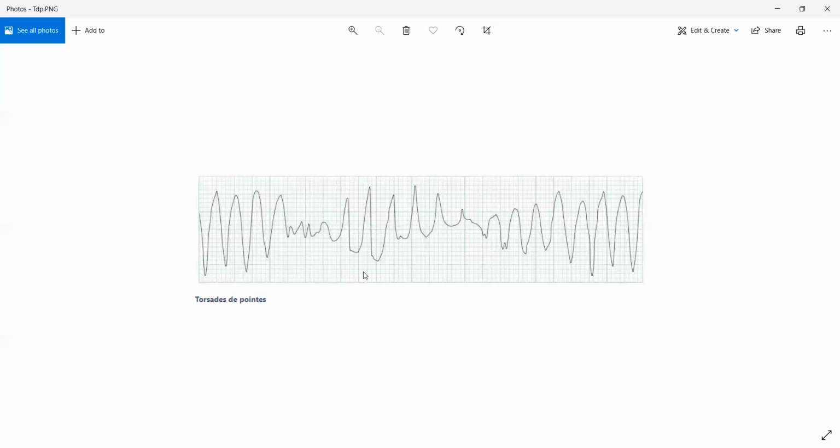What will happen with the regular or irregular? It looks irregular, but you can see that the QRS complexes are regular. The question is not about the regularity here. You can see that the shapes of the different QRS complexes are different, but they are occurring at a regular interval. Here the interval is regular. Again, here, in this half of the ECG, the intervals are regular as well. Here, the intervals are regular as well. So, in simple words, polymorphic broad complex tachycardia is Torsades de pointes.